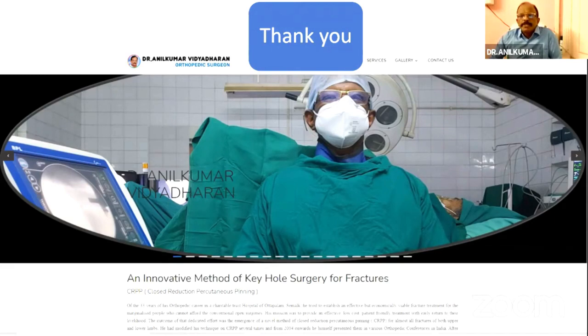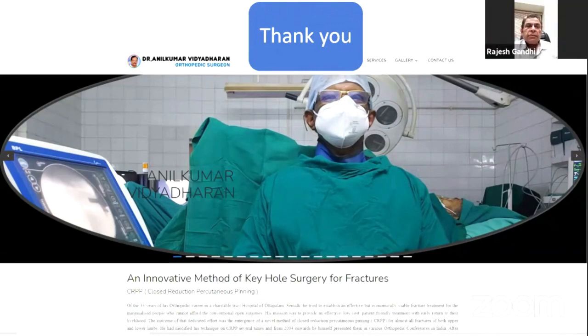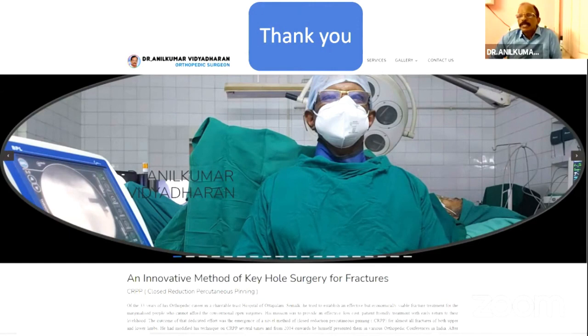Sir, previously I was doing the milking technique and also the joystick maneuvers, but with this technique of distraction, meaning a very good distraction, the proximal fragment is disengaged from the muscle mass by applying traction in a slight flexion, 20-degree flexion of the elbow. The distal fragment is held by one of my hands and flexed, so the proximal fragment will be disengaged easily from the muscle and we can reduce it also. Till the introduction of the wires, I will keep this traction without losing it. That is why I am not checking these positions also.